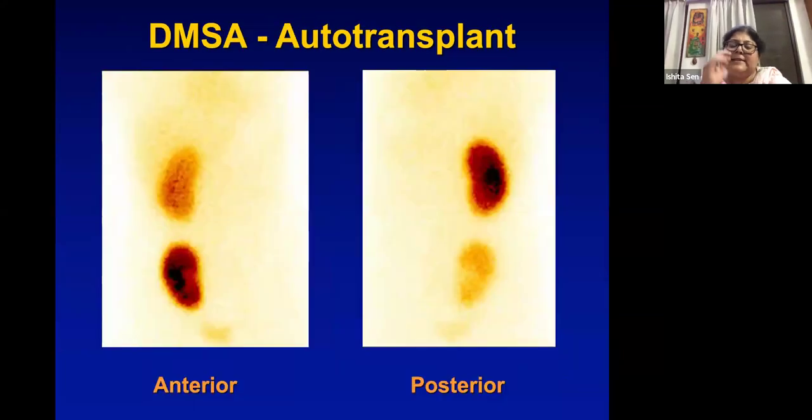So this is a DMSA scan. This is one of the scans which was given to me by one of my colleagues at PGI Chandigarh. And in this patient, you can see both the kidneys so beautifully on a DMSA scan.